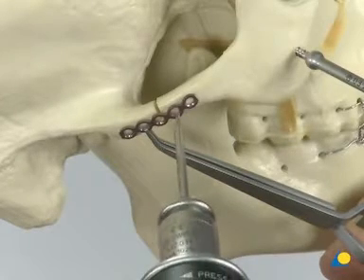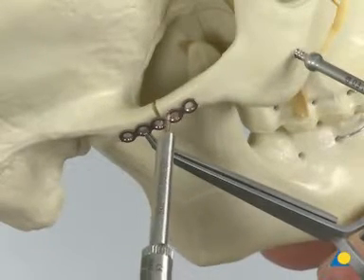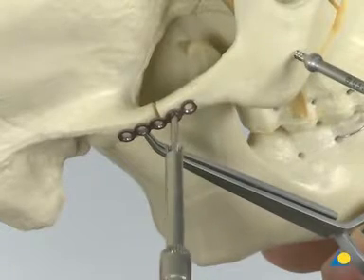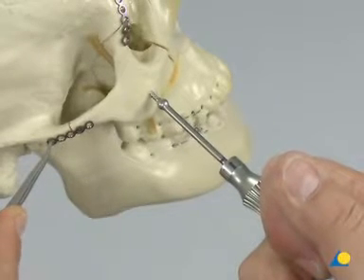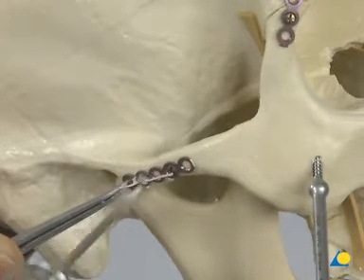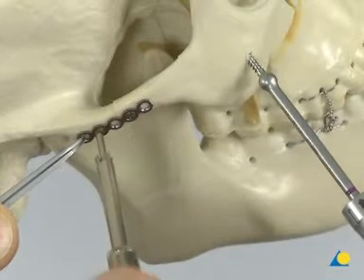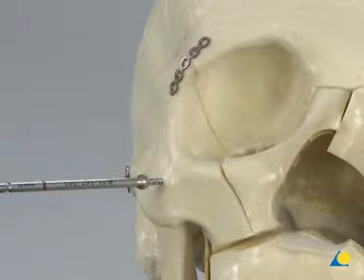The first hole is drilled close to the fracture line in the zygomatic segment, and a 6 mm long screw is inserted. To achieve a better reduction of the zygomatic arch, the T-handle and traction on the plate can be used. Another screw is inserted on the opposite side of the fracture line. The T-handle can now be removed.